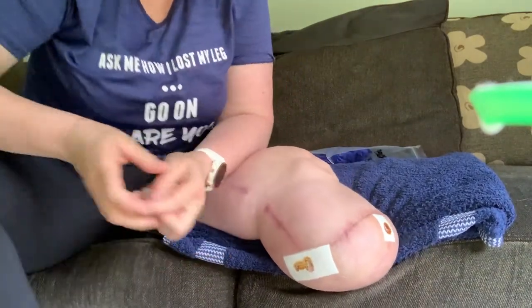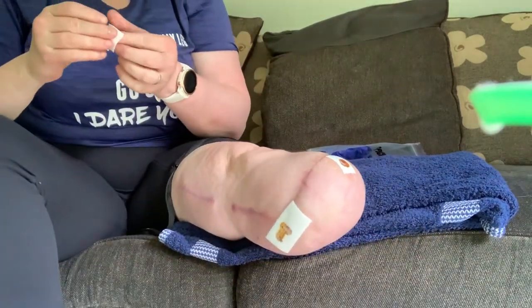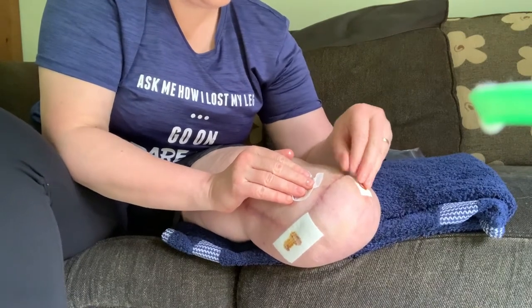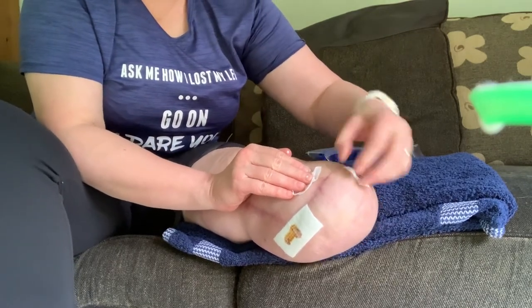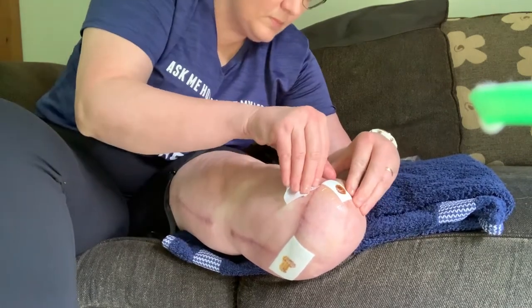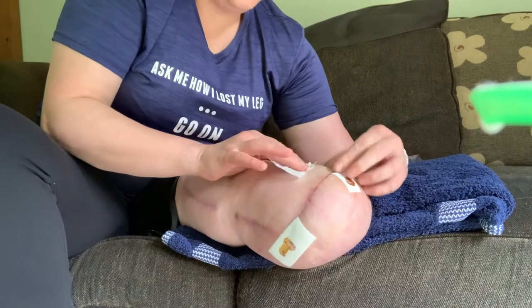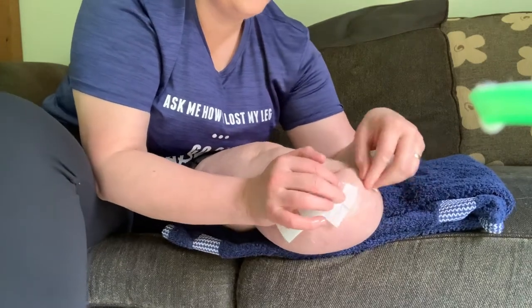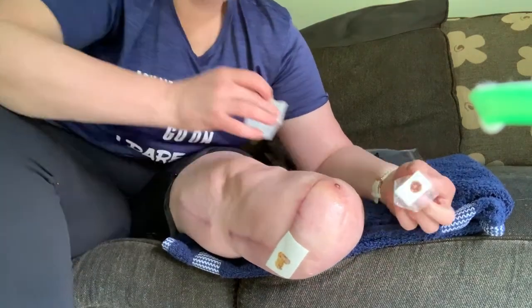We start with the removal wipes — adhesive remover. We're going to take the two dressings off first. It's a bugger getting these corners, especially when I can't feel it on my own leg. There we go, got it. The adhesive remover just helps protect the skin so we don't peel any layers off and it doesn't hurt. It's quite tricky down here because I can't actually see the end, but it came off relatively easily.